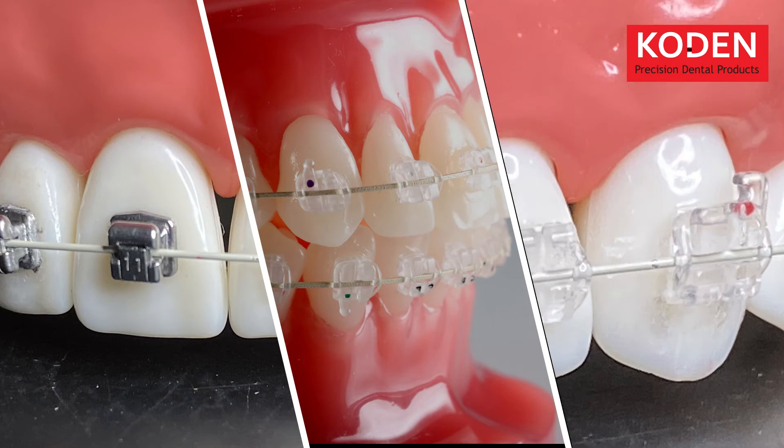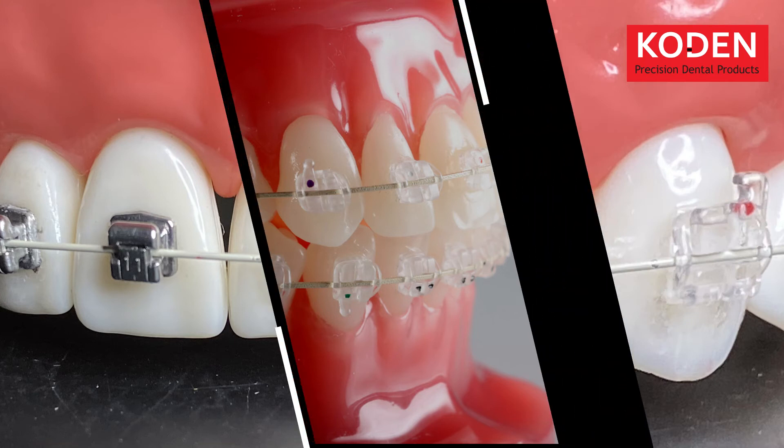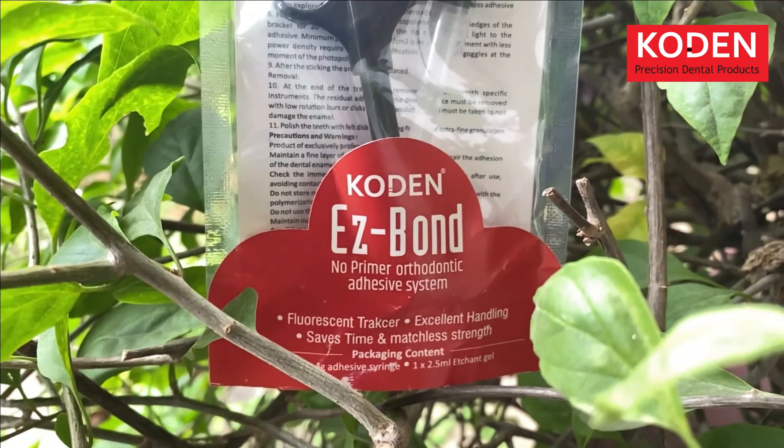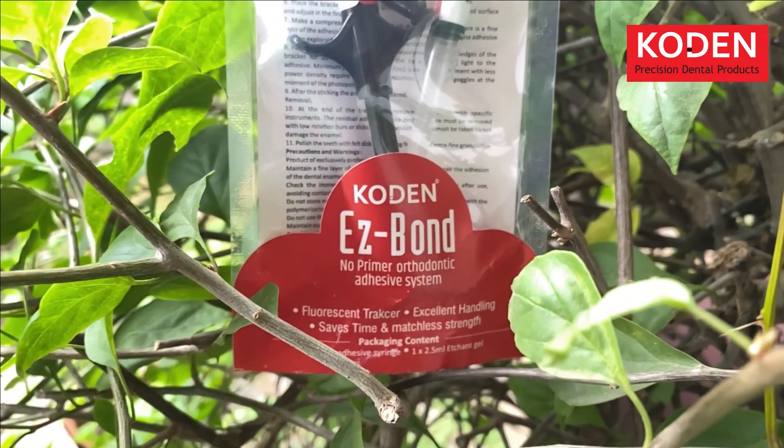With Easy Bond's flexibility with multiple appliances, it bonds with all types of brackets and tubes, making it your go-to product. Easy Bond — the 21st century orthodontic adhesive.